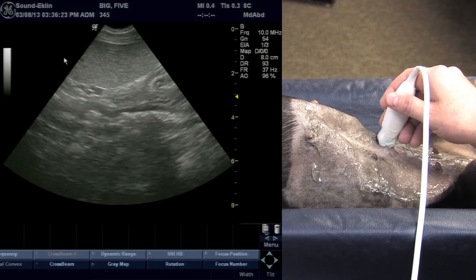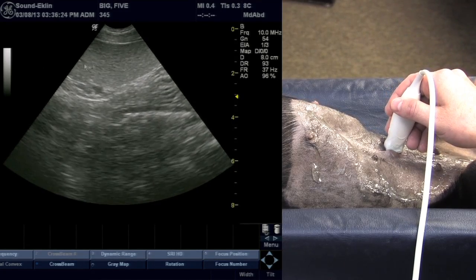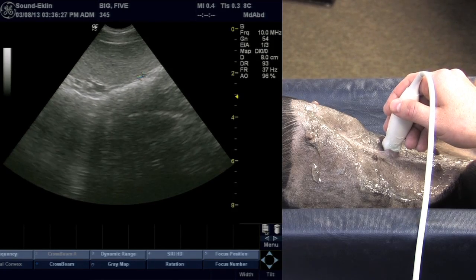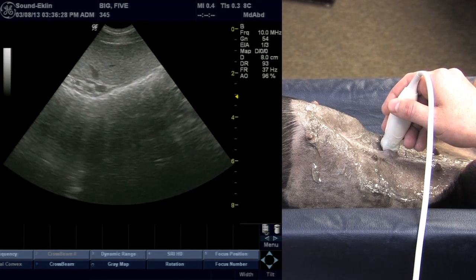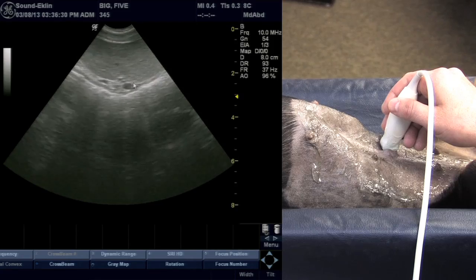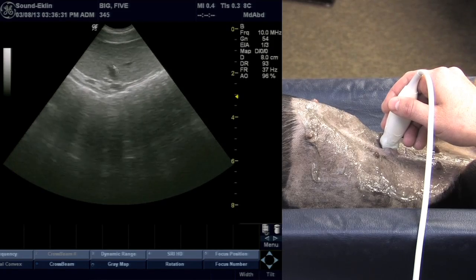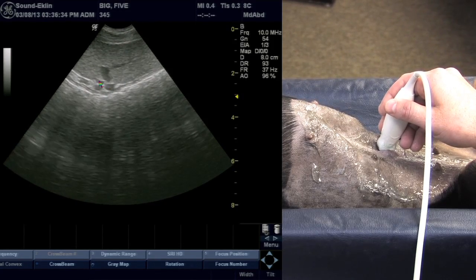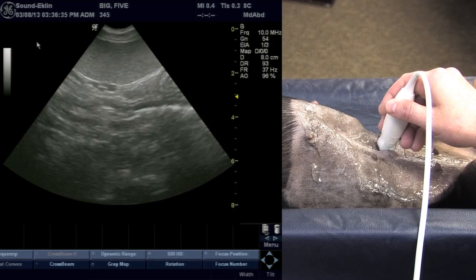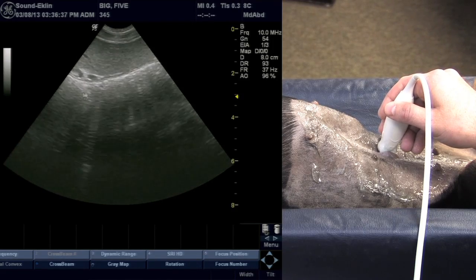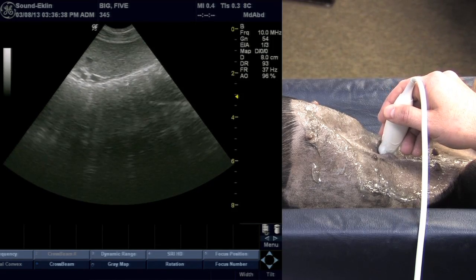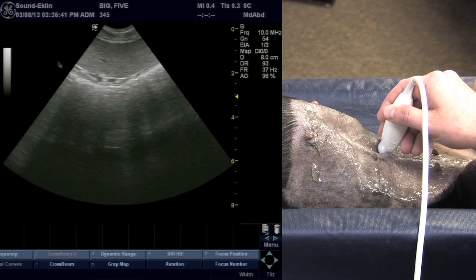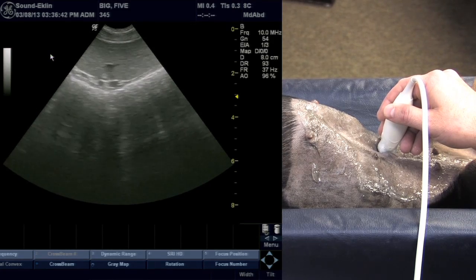As we're evaluating the spleen, it's important to notice the nice smooth echo pattern that's present and that we have a capsule that gives a specular reflection around the spleen. Here we're at the center portion, which is the splenic hilus, and that's the splenic vein. As I slide a little medial, the structure coming underneath the spleen is the colon wall.